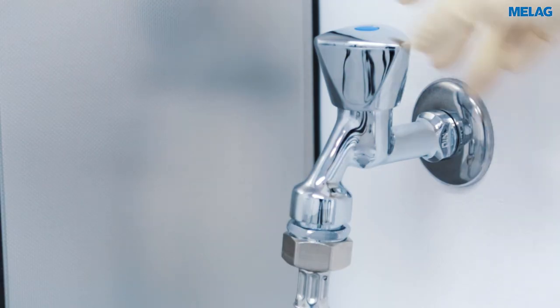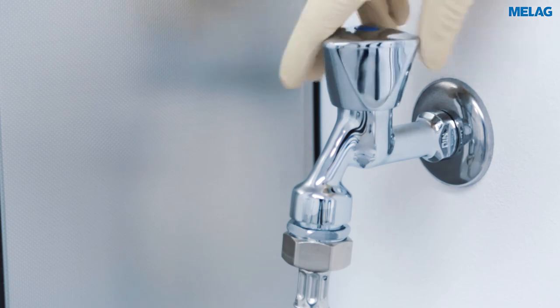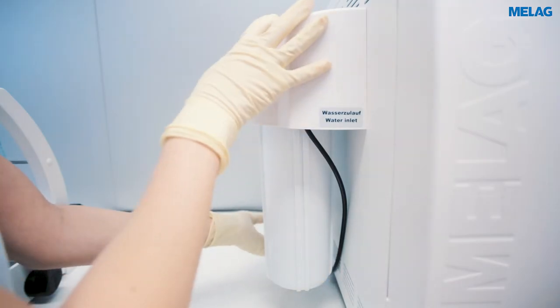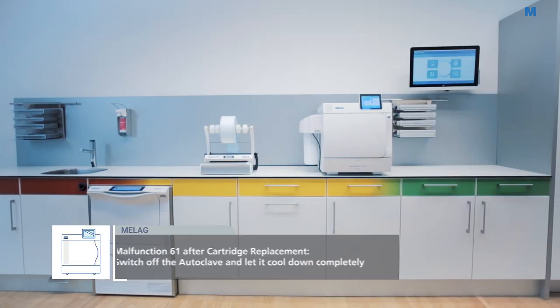After you have reopened the water tap and have checked the Meladem 40 for leaks, your steam steriliser and water treatment unit are ready to use.